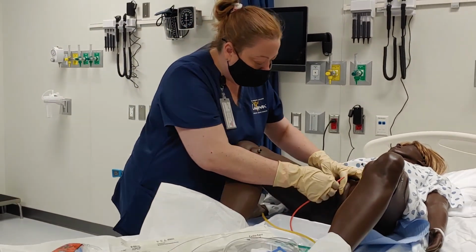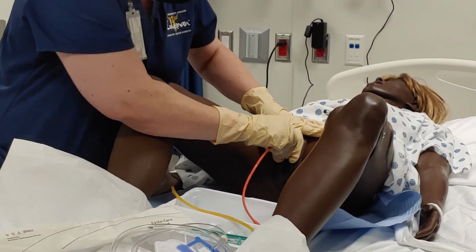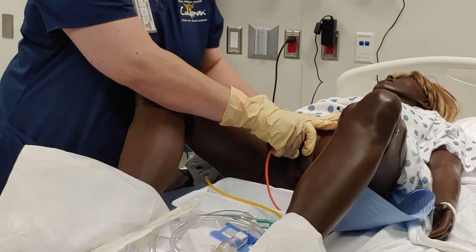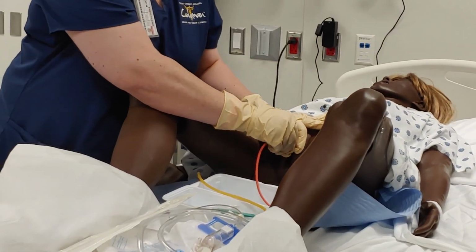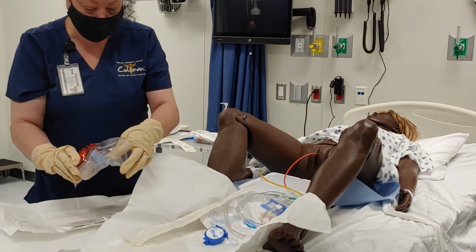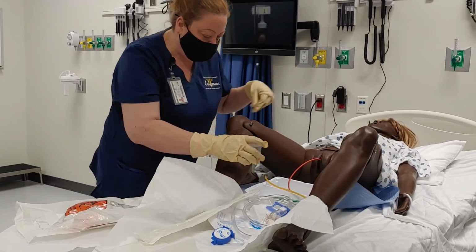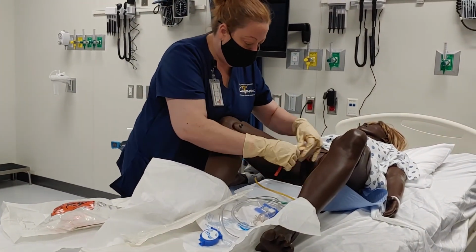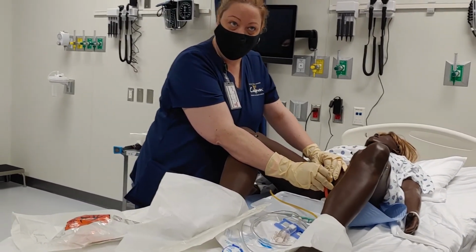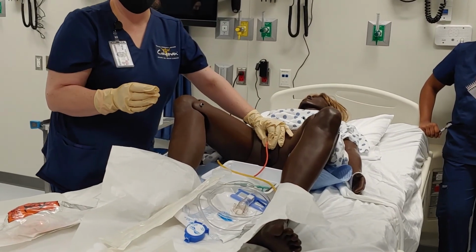So that's the only difference, when you're putting these in, you have to make sure that this stays inside some type of receptacle, all right? Because when you put it in, it's immediately going to start flowing out. Now, if I were doing this as a straight cath to get a sample, I would get that pretty much in place, have my cup sitting here, and then hold it over the cup, get the sample, and then I can let the rest of it flow out into my little pan, okay?